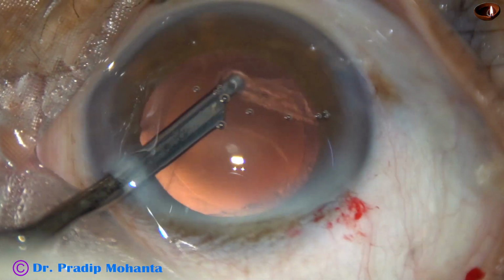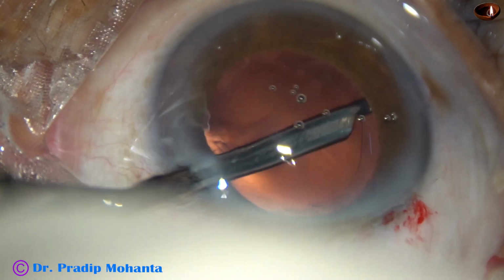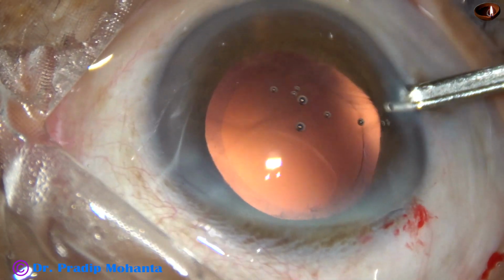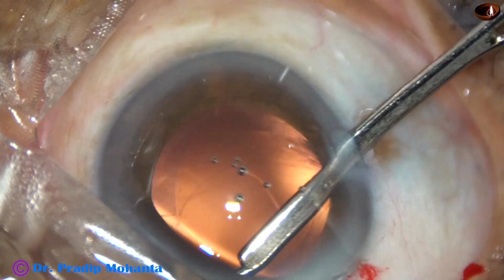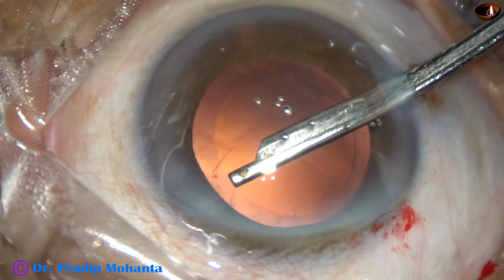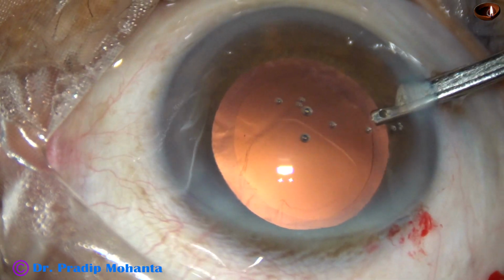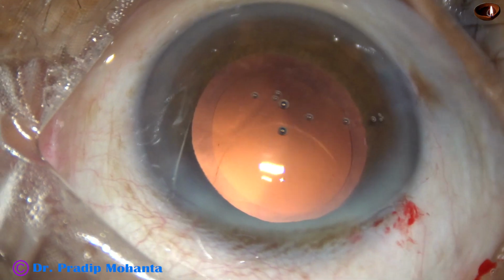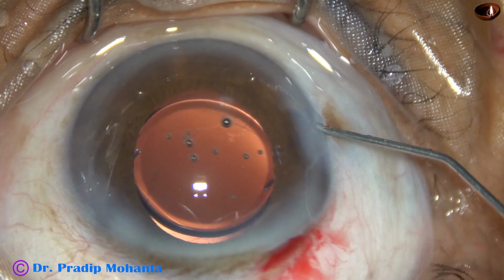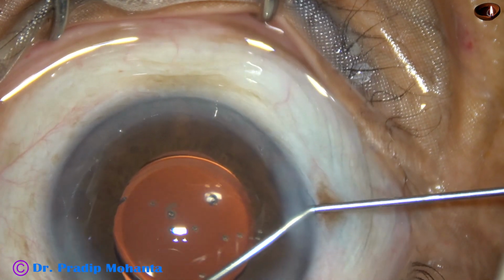Introducing the Simcoe through the left, we can clean the cortex from 7 o'clock to 10 o'clock. Introducing it from right, we can clean the cortex from 10 o'clock to 1 o'clock, and thus 360-degree cortical cleanup is performed. After cortical cleanup, a multipiece intraocular lens has been placed, in this case in the sulcus. This portion of the video has been edited.